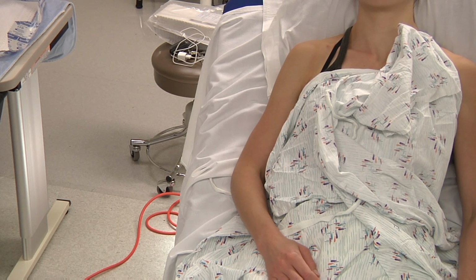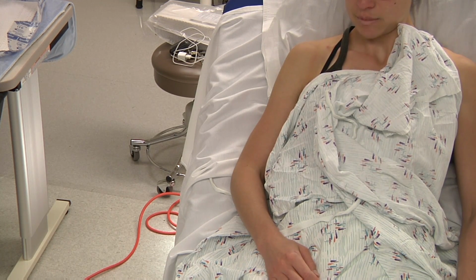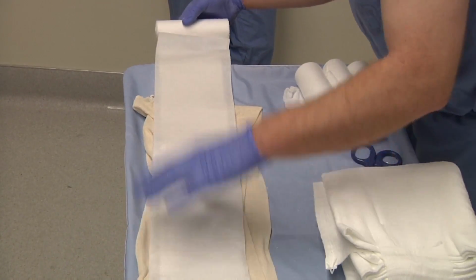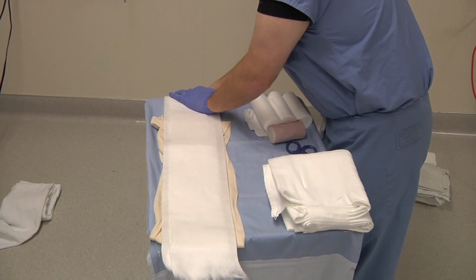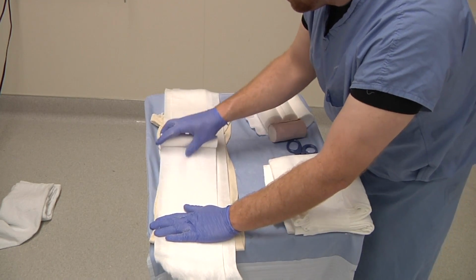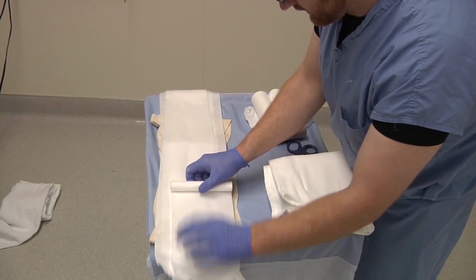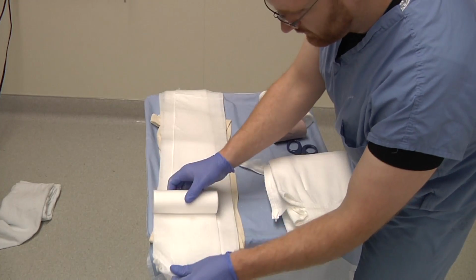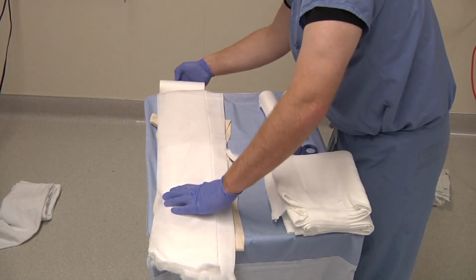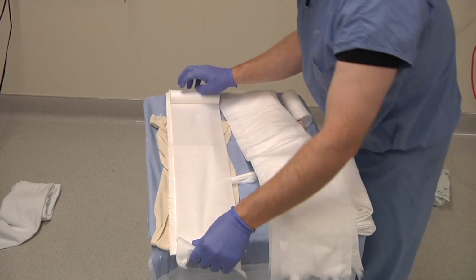The next step is to make your padding for this. How we do this is by measuring how long, using our measured plaster, and by about 2 inches on either end, just start layering about 5 or 6 layers of our cotton web roll, offsetting it a little to adequately cover our plaster. The width of the plaster is 5-inch and the web roll is 6, so it does have some natural cover. We are going to need 2 of these, one for each side, so repeat the process.